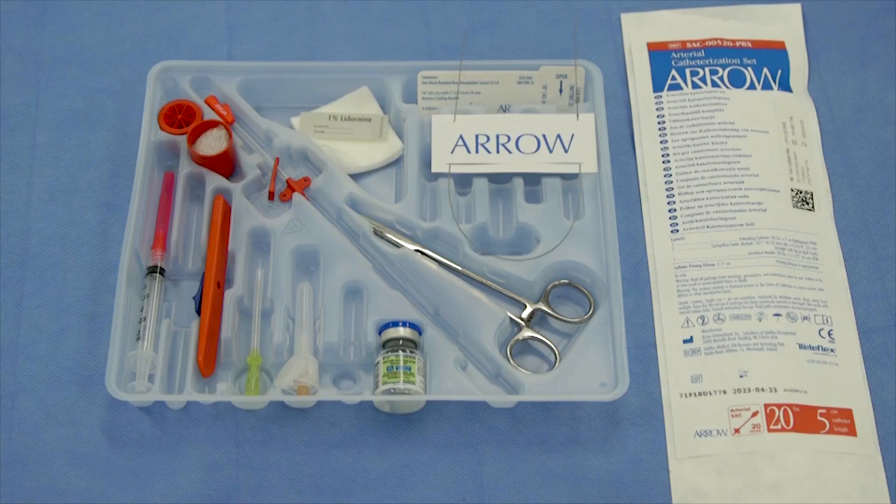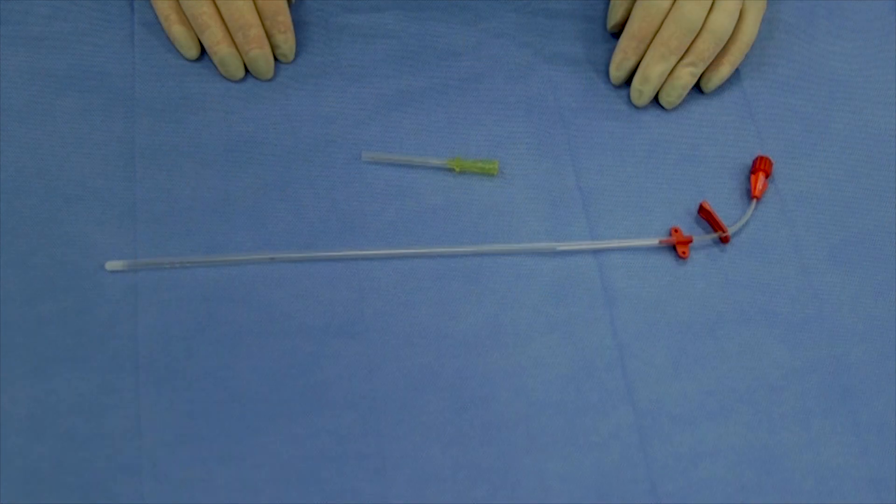This video demonstrates the insertion of the Arrow Seldinger arterial catheter using the standard Seldinger insertion technique with ultrasound guidance. The Arrow Seldinger arterial catheter from Teleflex is designed to improve patient safety by eliminating confusion of catheter identification, reducing complications associated with insertion technique, and providing optimal performance leading to effective treatment for patients.